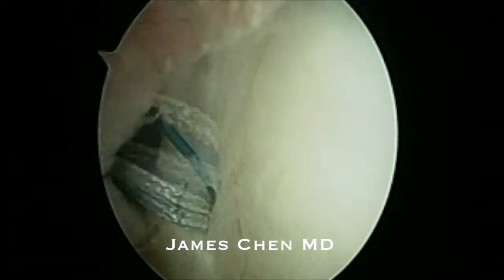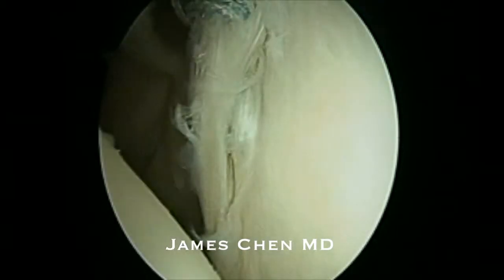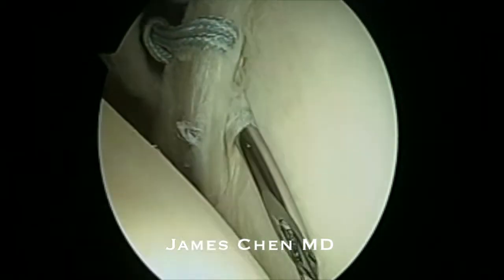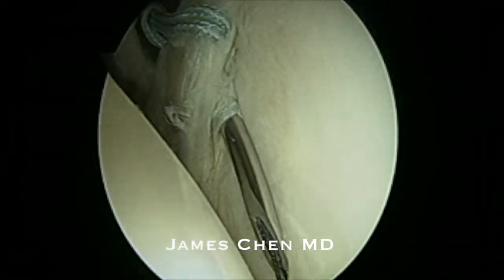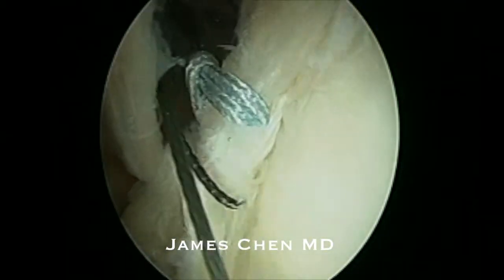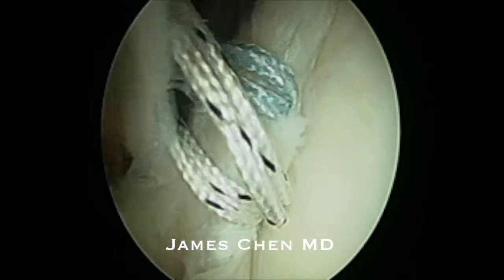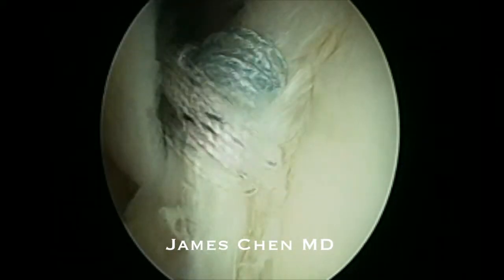I've then shuttled a number two fiber wire and created a racking hitch stitch. I then use a crescent suture passer and pass another passing suture through the labrum. Once again I pass a number two fiber wire and then create a racking hitch stitch.